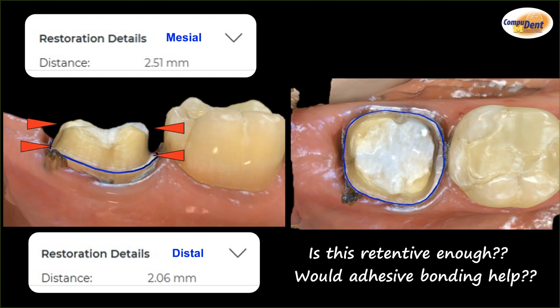But what about bonding zirconia? And I think that's been a big question in this short clinical crown. People like the thinner dimension on the occlusal that zirconia can offer. But when you get these short preps and you can't do a really nice geometrical prep for retention, can I bond it and get a good result?